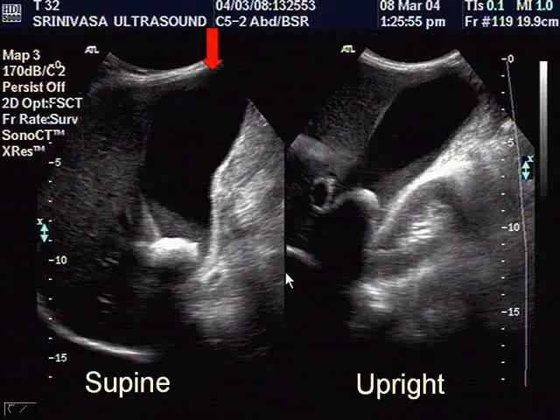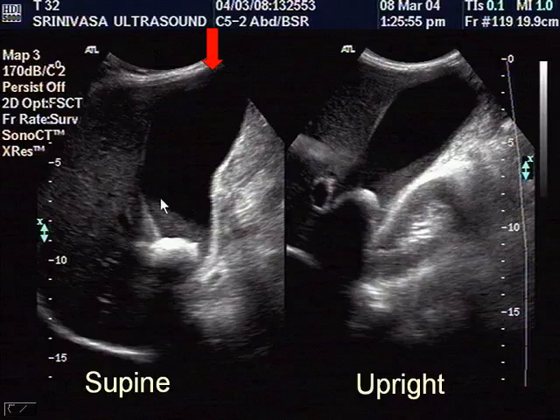So here is a gallbladder which is definitely dilated. There is a stone sitting in the neck of the gallbladder. There is a shadow there, and when I put this patient upright, the stone is stuck in the neck, so it's impacted, and there is also a clear bile debris level. This level is in this orientation in supine position, and the level changes when I put the patient into upright position. This red arrow, I have pressed on the fundus of the gallbladder under ultrasound control, and the patient says, that's exactly where you're hurting me. If I go a little that side or this side, the patient is comfortable. So that's the sonographic Murphy's sign, very important.